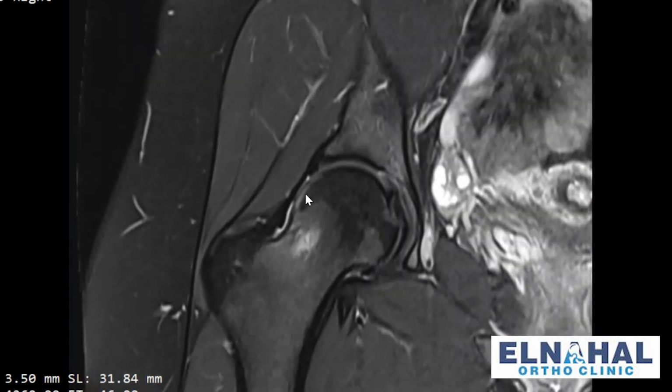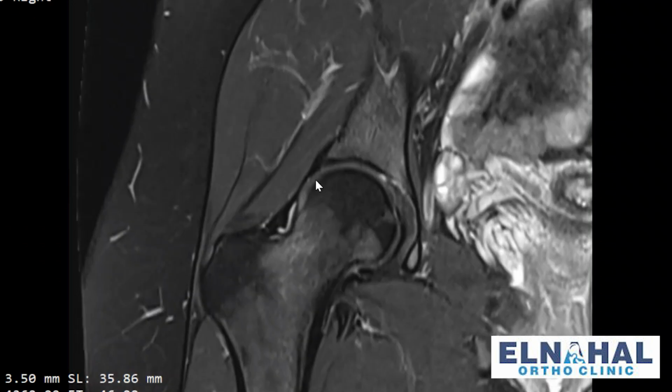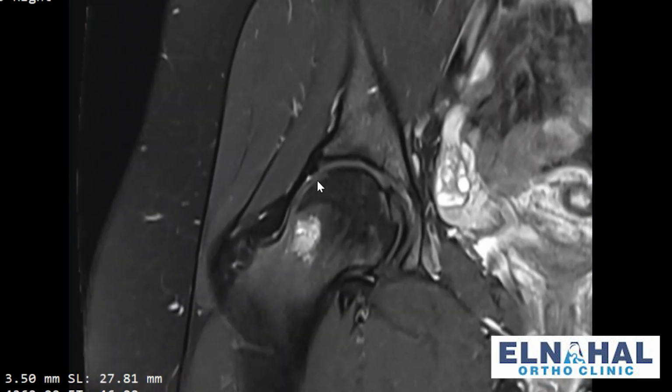This is an MRI scan of a 22-year-old student, and we can notice here a tear in the labrum, and we can notice that the head is aspherical, which is what we call a cam lesion, and there's also a cyst here called an impingement cyst. This happens when the head collides with the socket. So how does this collision happen?